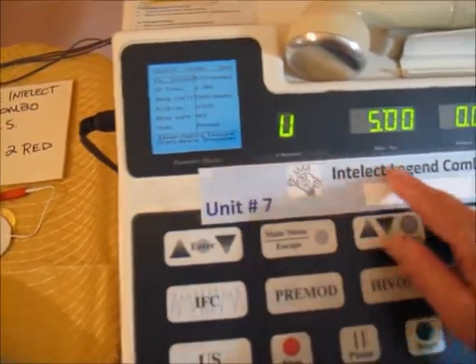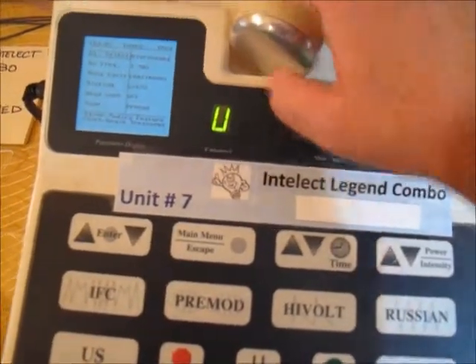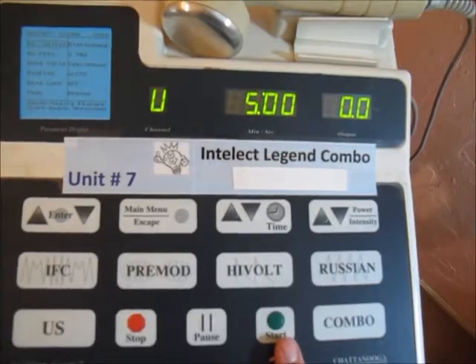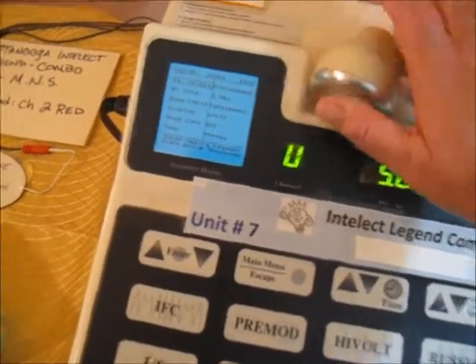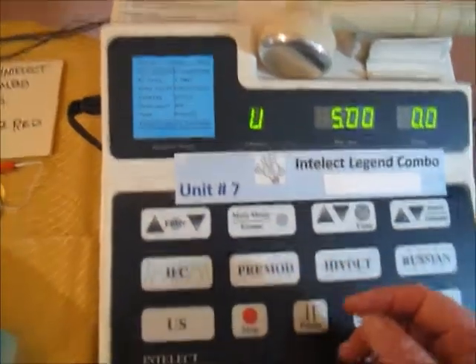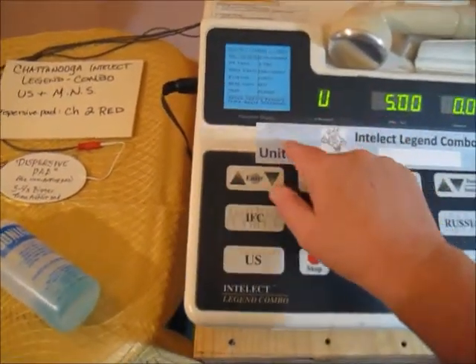Now hitting the intensity will bring the ultrasound up. Remember, ultrasound will not turn on unless you hit the start button first — so hit start, then adjust ultrasound intensity. Never run the ultrasound head in the air, as it will break the crystal. That's a quick overview of combo mode with pre-mod.